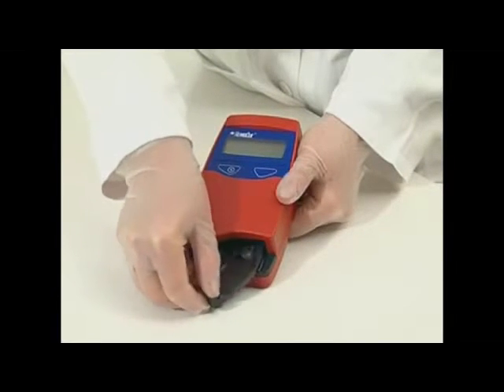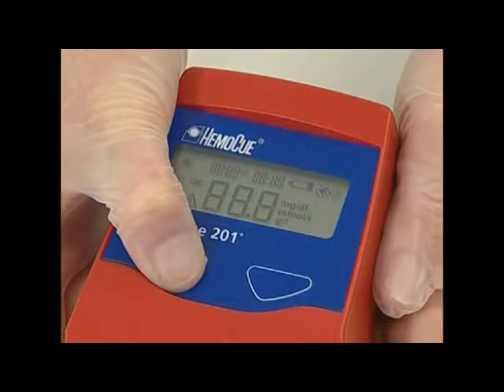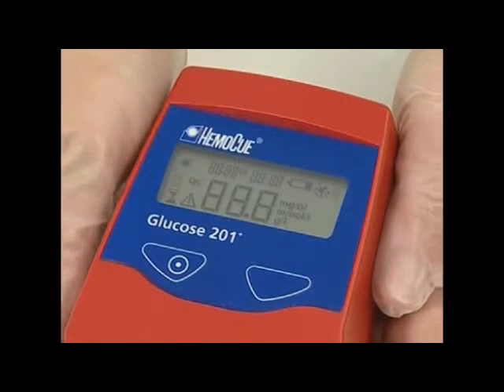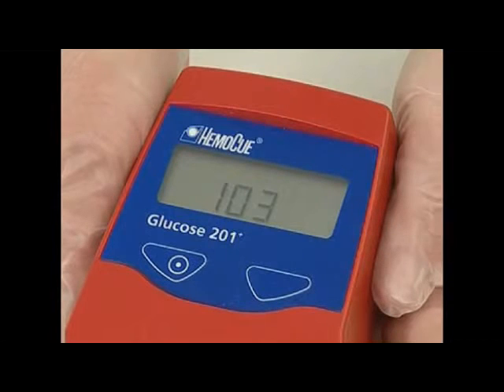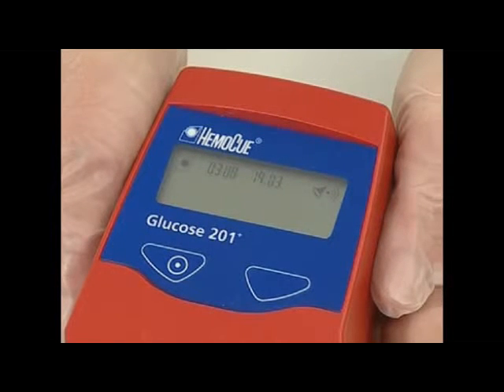Rotate the cuvette holder out to its loading position. Press and hold the left button until the display is activated. The display shows the version number of the software program, after which it will show an hourglass and GLU. During this time the analyzer is performing a self-test, which automatically verifies the performance of the optronic unit. After 10 seconds the display will show three flashing dashes and the HemaQ symbol, indicating that the analyzer is ready for use.